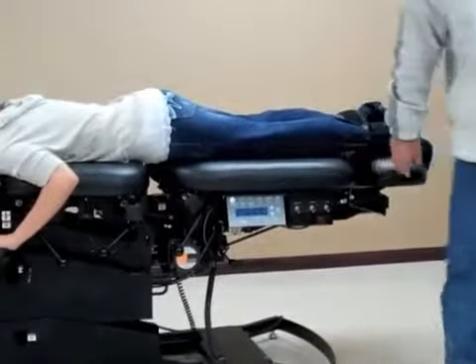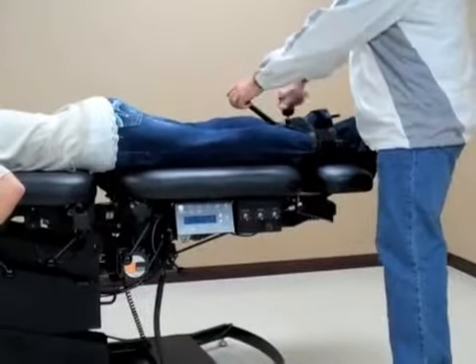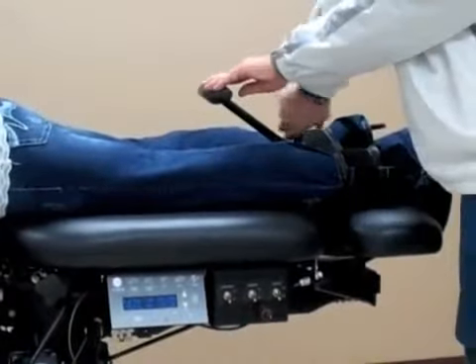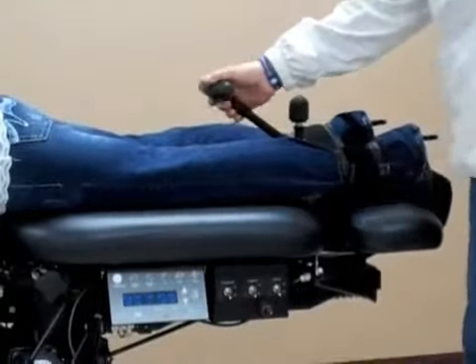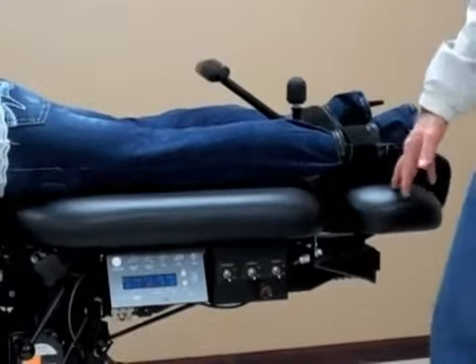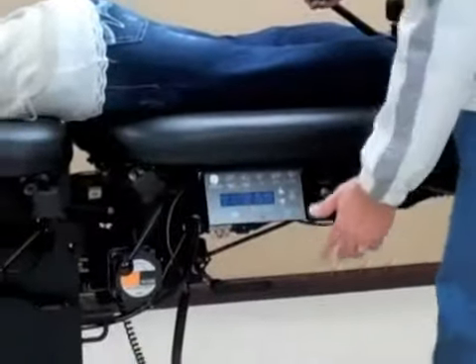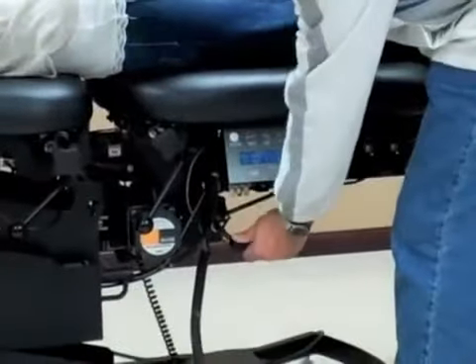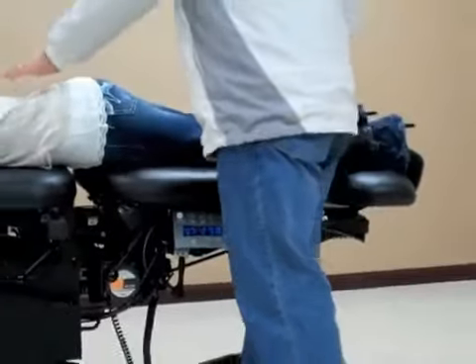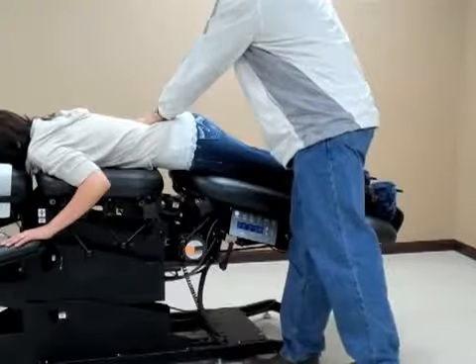The first step — if we want to do any manual flexion, we can insert the T-bar and tighten the knob by twisting and securing the handle for our flexion, whether it be to manually flex the table or to lateral bend the table. To engage the manual flexion, I'm going to release the lever upward, and at that point I'm able to do my manual flexion by securing the table and flexing it downward.